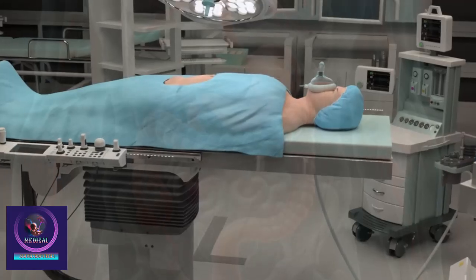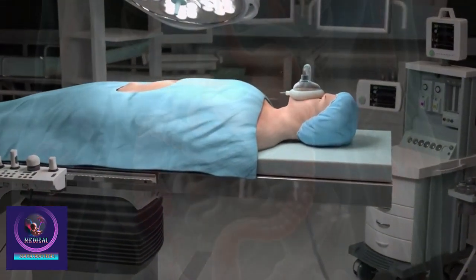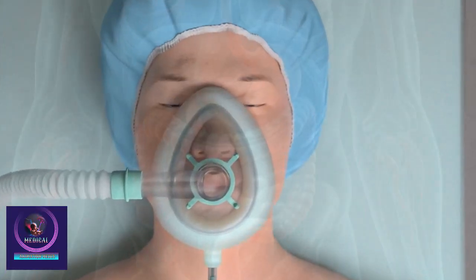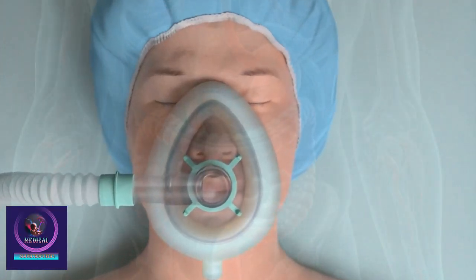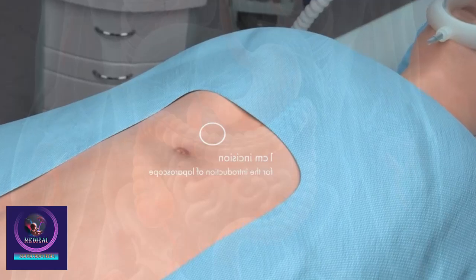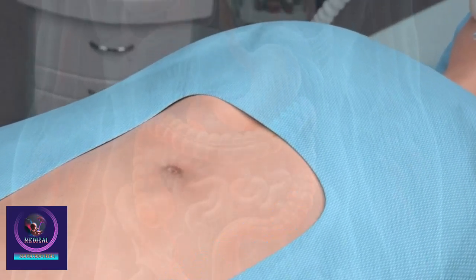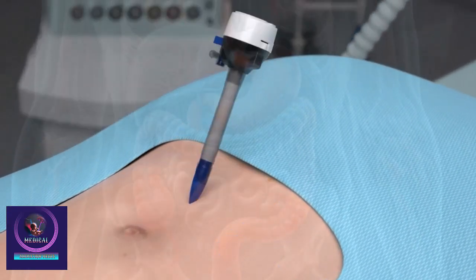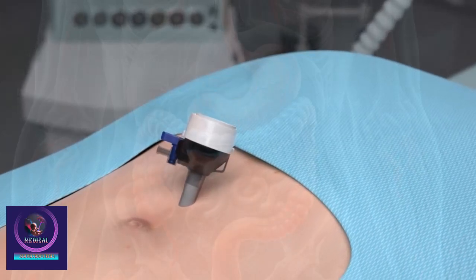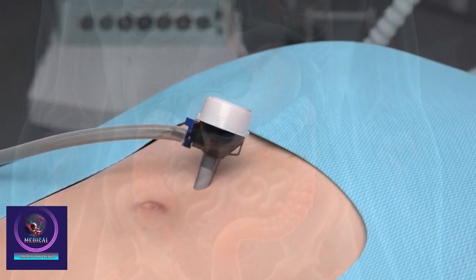The operation is performed after intubation and general anesthesia. After anesthesia, an incision of about 1 cm is made in the umbilical region. Carbon dioxide is injected through a trocar, and the pressure of carbon dioxide is used to secure the extraperitoneal space.